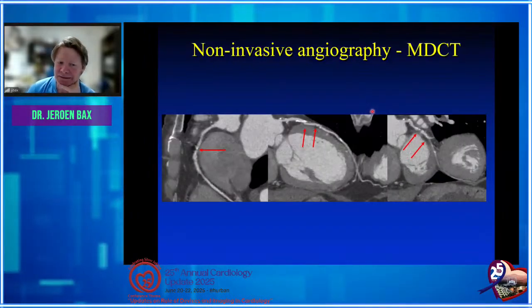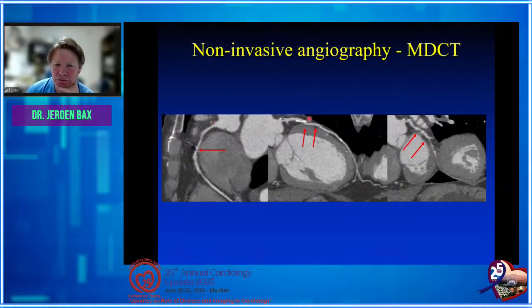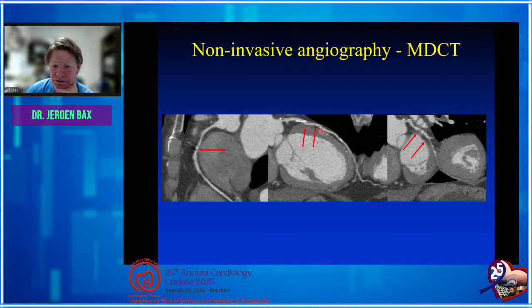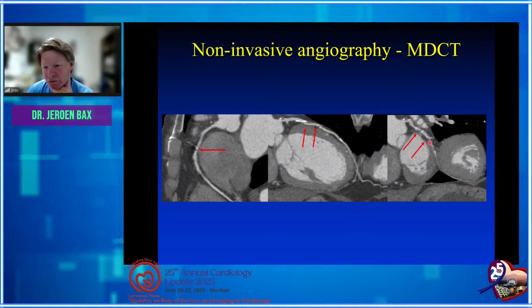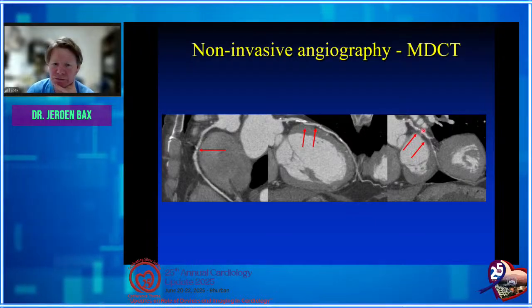This is what we get often. So here is some calcium. Here is mixed lesions. Here is a calcium. Here is non-calcified. Here is non-calcified plus calcified. And here is very diffuse calcified spots and non-calcified lesions.